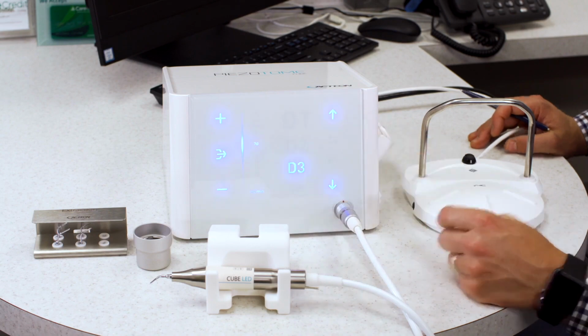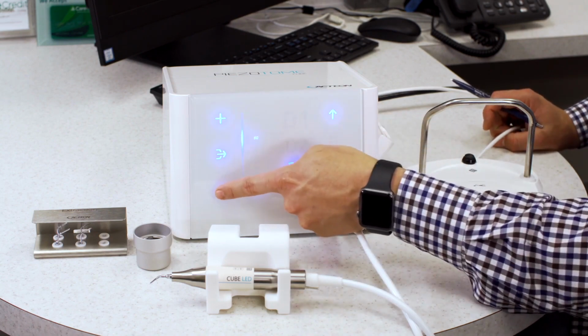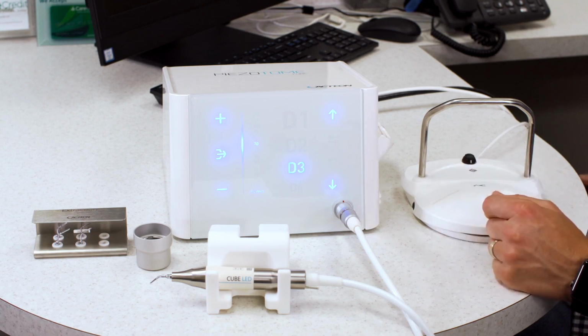I usually like to look at 60 or 70%, but you can increase up to 100% water output, or you can decrease down to 60%. So that's your water output and your power. Really there's only 2 controls for the Cube, so it's pretty simple as far as that's concerned.